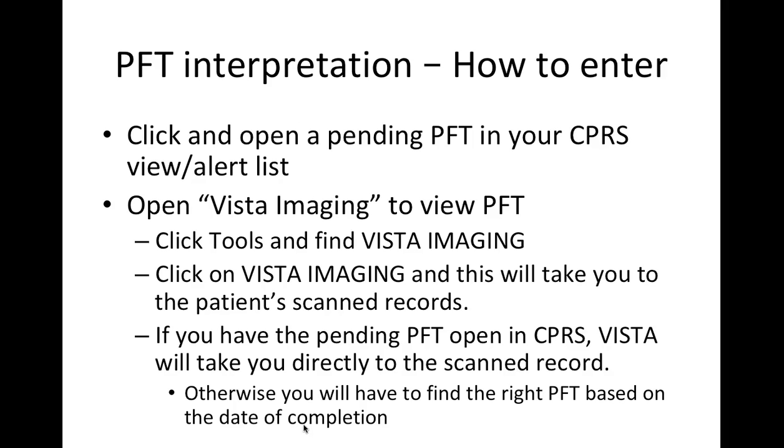Click on the Vista Imaging title and this will take you to the patient's scanned records. Now if you have the pending PFT open in CPRS, Vista Imaging will take you directly to the scanned record associated with that PFT. However, if you do not have them open or there's a communication problem between CPRS and Vista, you may have to find the right PFT based on the date of completion.